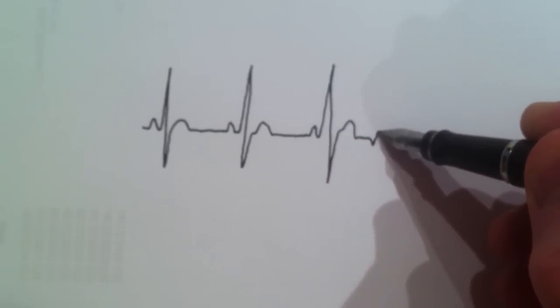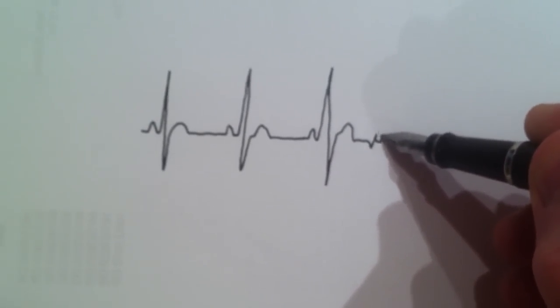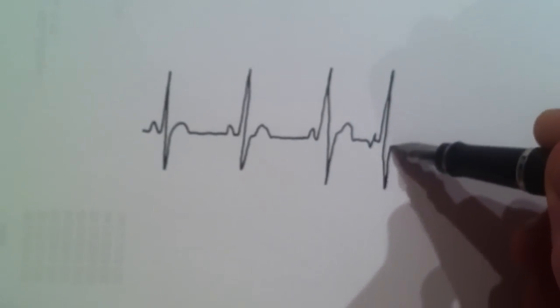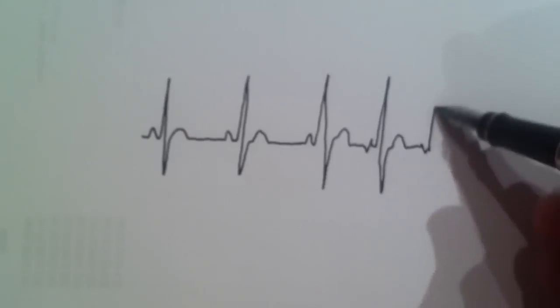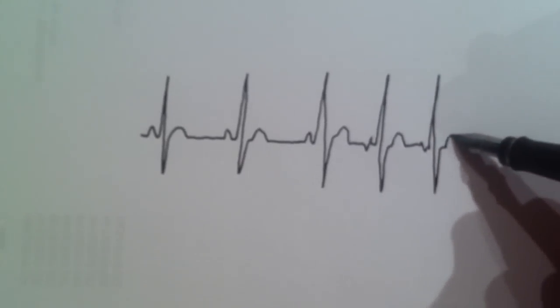And then there's an early beat, slightly different shape. P wave, QRS, looks the same. Recovery, that's an early beat. And then second early beat, so this is an ectopic beat.